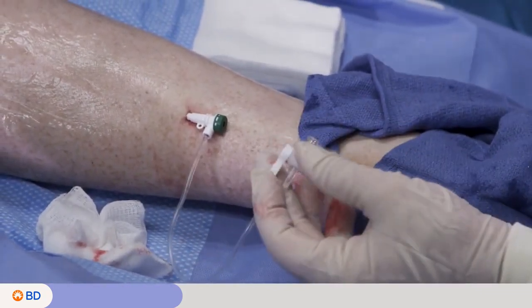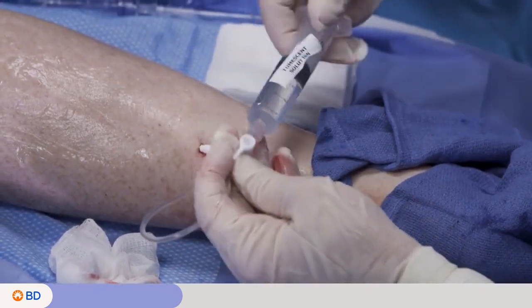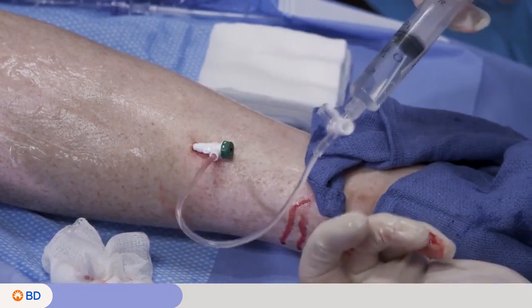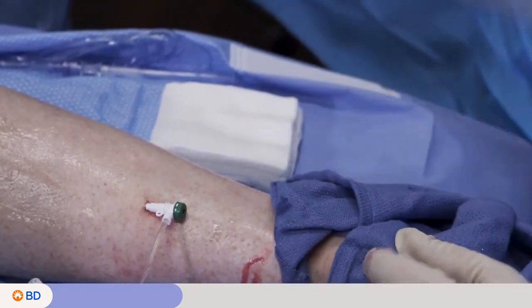It's good practice to make sure you can aspirate and flush. If it's a small vein and there's spasm on the vein, it may be very difficult to aspirate back, but you can see it's pretty easy to flush the catheter. And we know we're intraluminal.